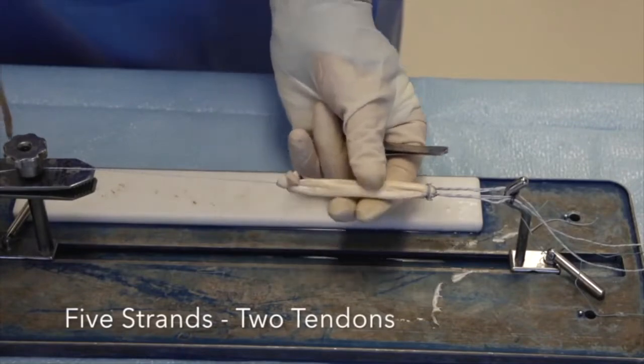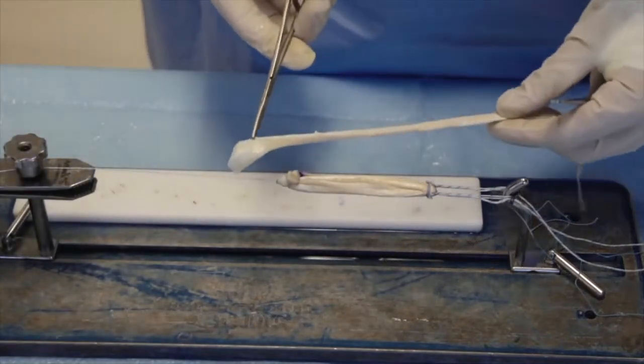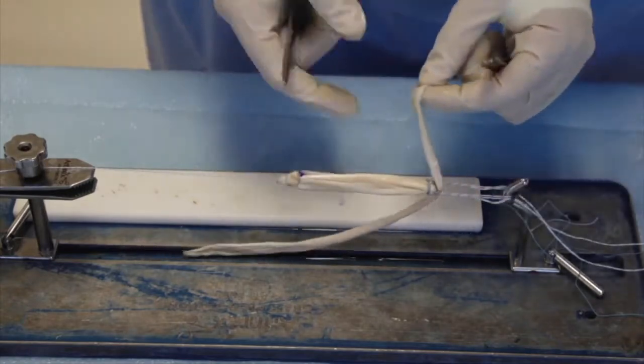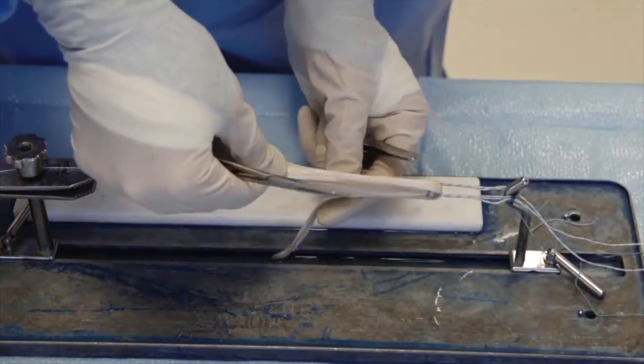Next we will demonstrate the five strand technique with two tendons. A three strand graft is prepared with one tendon as demonstrated previously. The other tendon is loaded in the same suspensory device alongside it.